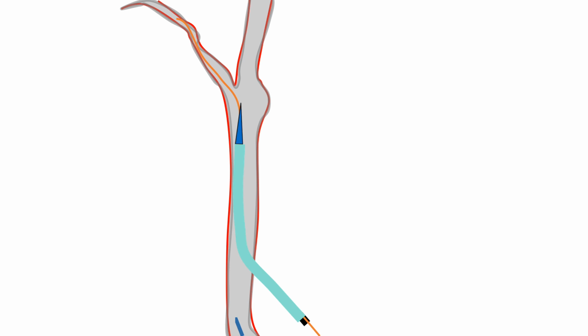Now, once you've taken the sheath just below the bifurcation, take a sterile tape and tape it, or take a Tegaderm and tape it completely to the neck, because the sheath should not kick out when you do a procedure. Once you've done that, it's simple. Take out the wire, change the wire to the right direction, and take your device.